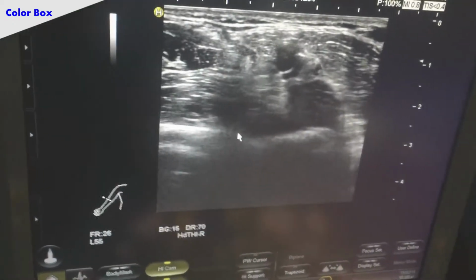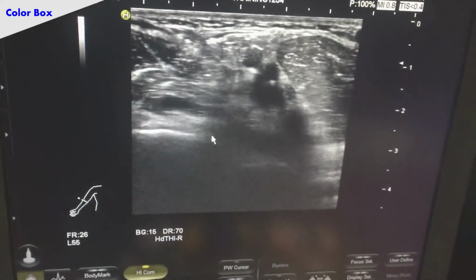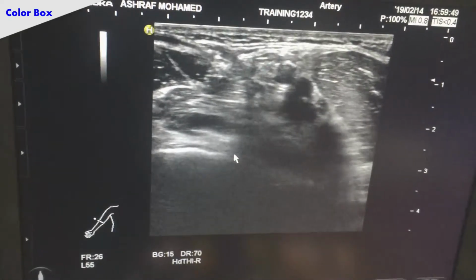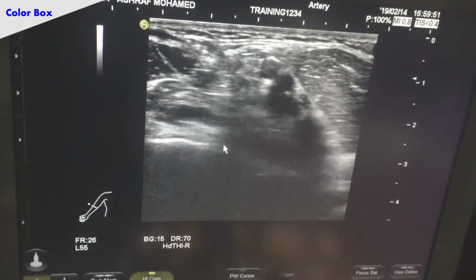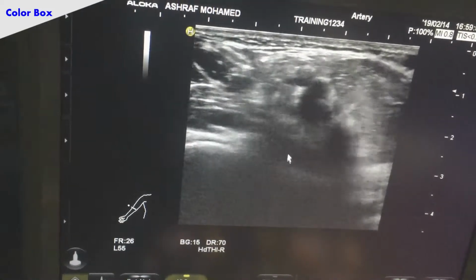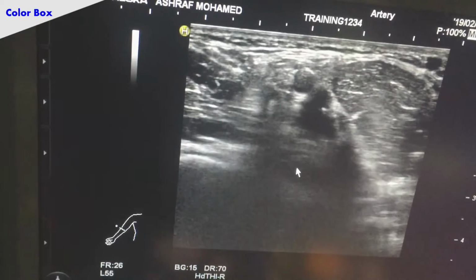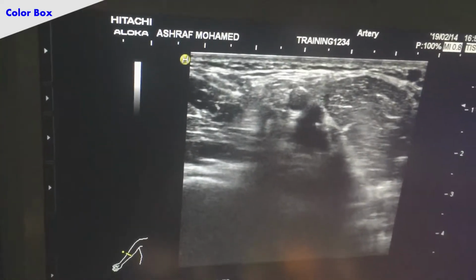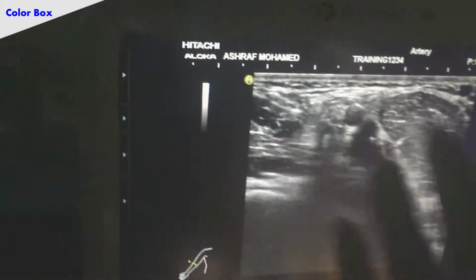Why do I do this? I do this to make it easy to save what is happening here, to save this image without typing many items. If I save it like that, let us do a test. Now I will save this area: freeze, then record 1 or record 2 according to the type of machine. Like this, record 2. It is not saving the picture here, which means record 2 is likely saving a movie. Forget that movie. Look at record 1.